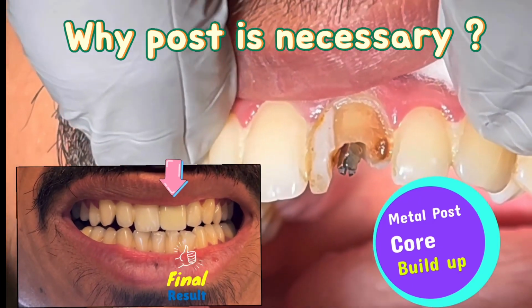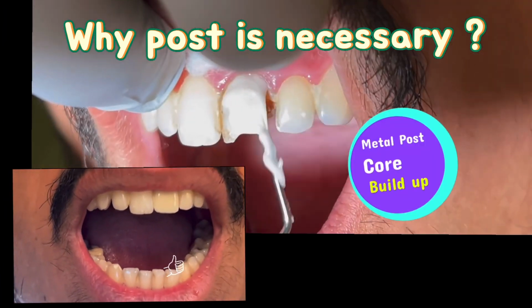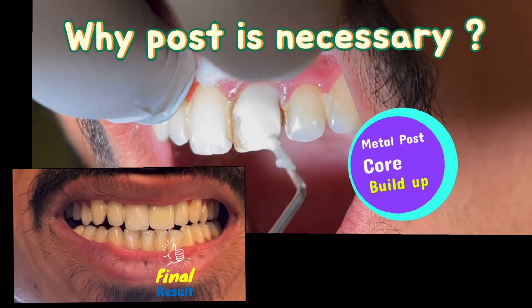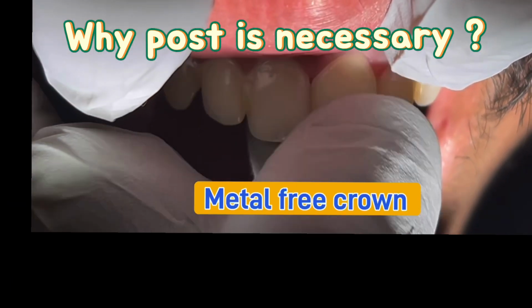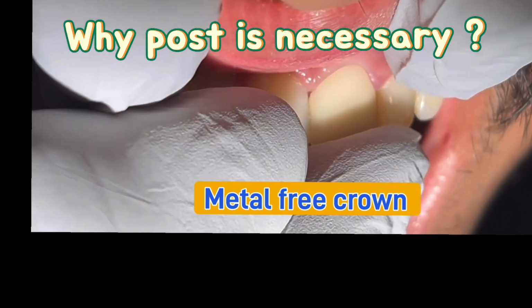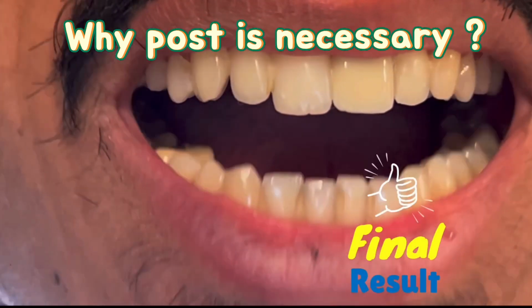Generally, if there is an infection in the tooth, a cap or crown is placed directly after root canal treatment. And ideally, if the tooth is significantly damaged or a large portion is broken, a post is placed after the root canal treatment, and then after building up the tooth, a cap or crown should be given.